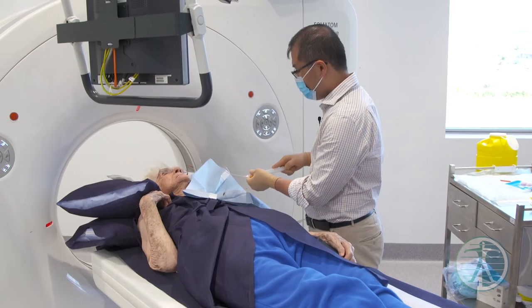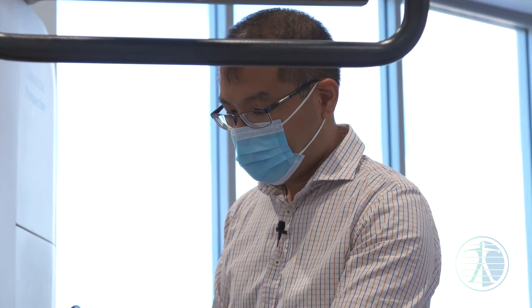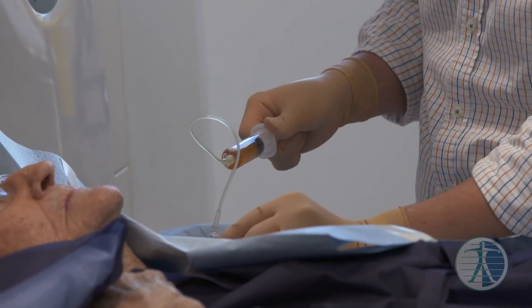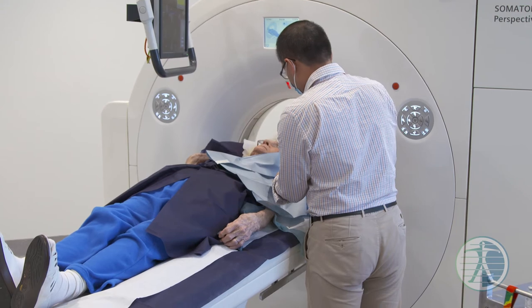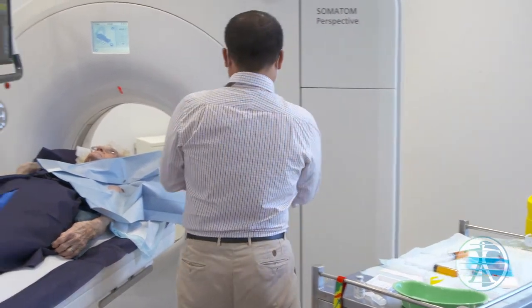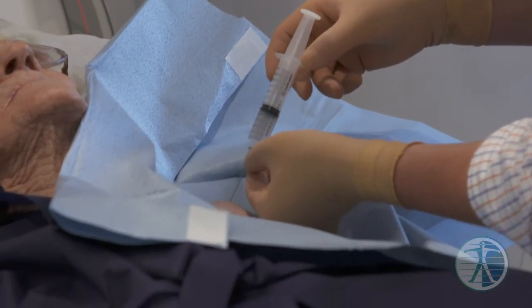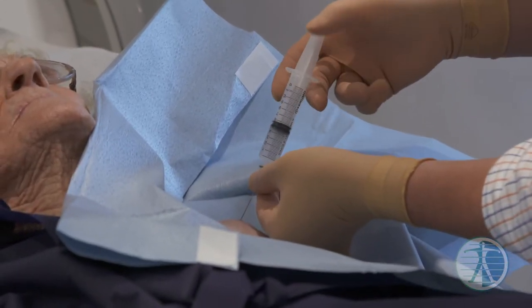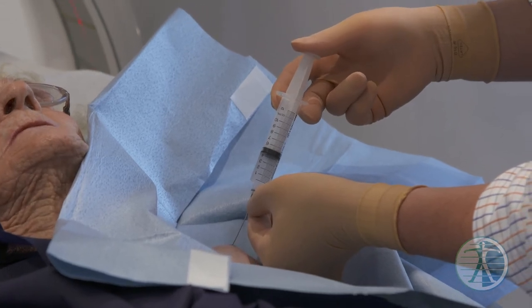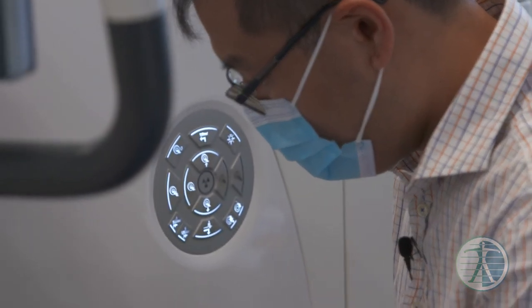All you need to do is stay still. Now we're going to put the medication in. Once we confirm the joint position, we will inject steroid and local anaesthetics into the joint for pain management.